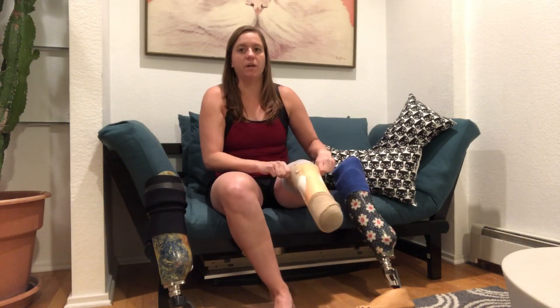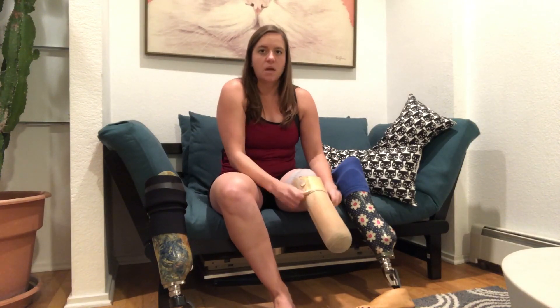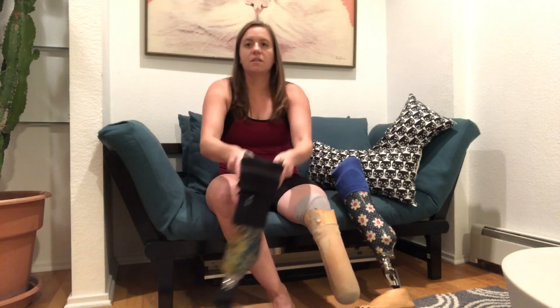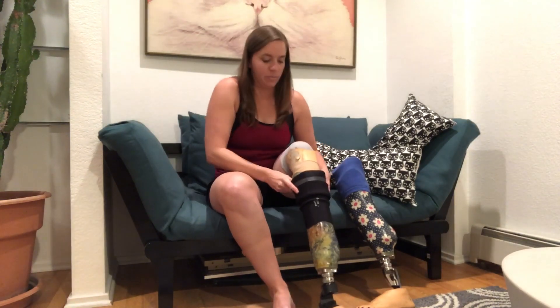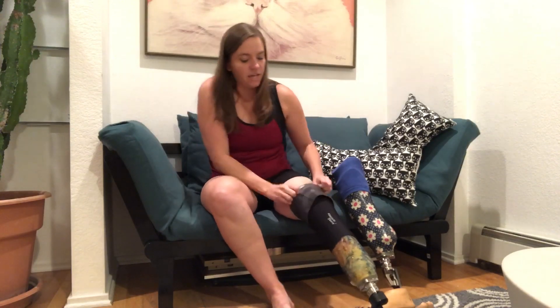The bottom of my leg is bigger than the top, so once I've got those layers on I can put my everyday leg on. Then I have this sleeve that gets rolled up to create suction so that my leg stays on more securely and I don't have as much up-and-down movement in the socket. That up-and-down movement — or pistoning — can cause a lot of sores on my leg.